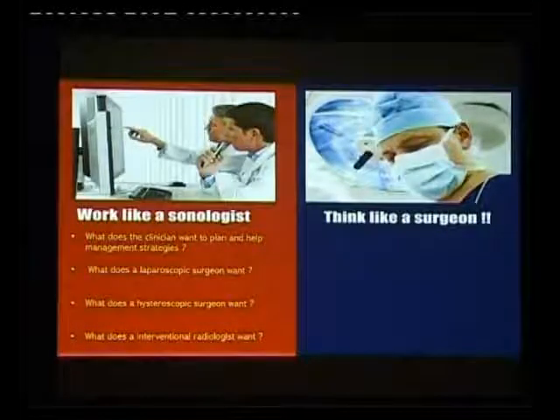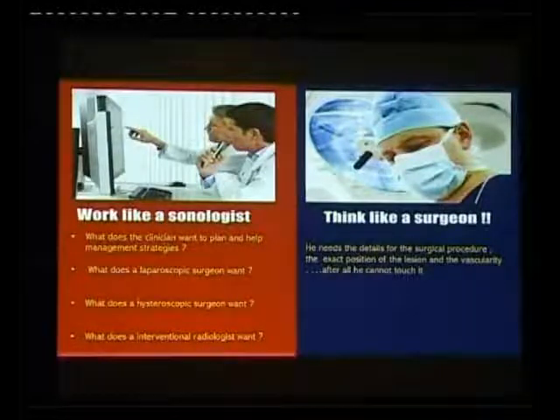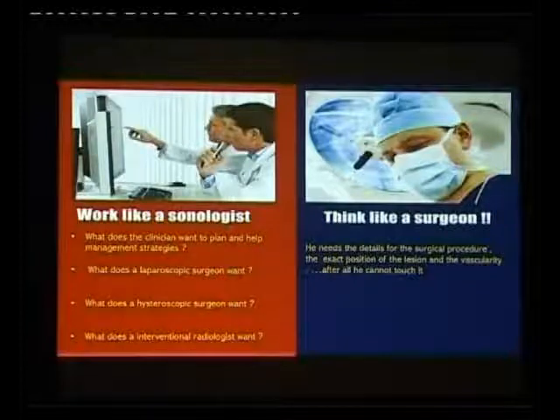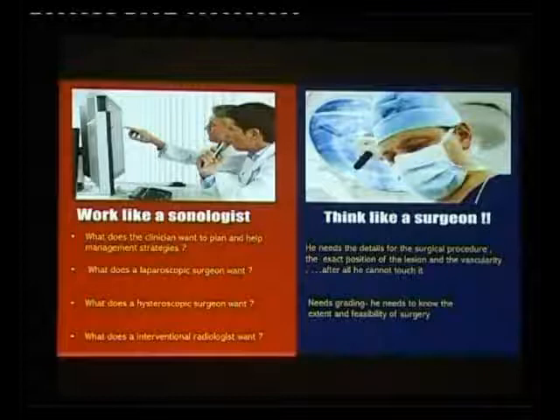But we think like surgeons, because we have to realize that what a surgeon needs is the details, the vascularity, because he cannot touch the object before he really operates on it. He also needs to know the grading, because this is necessary for his planning of surgery.